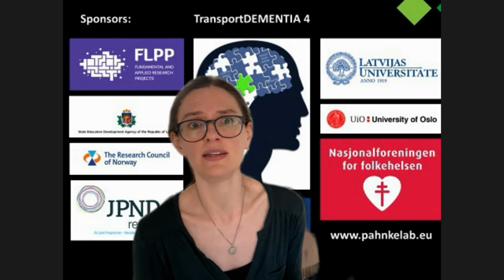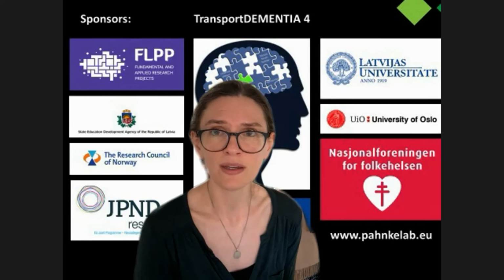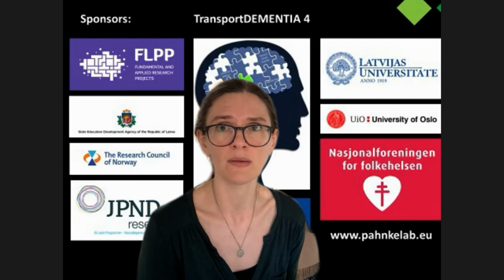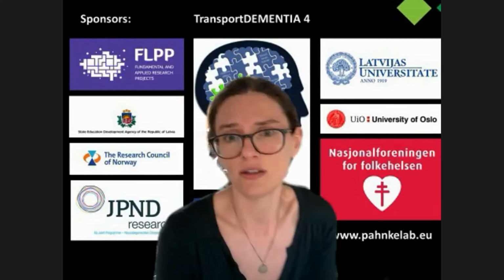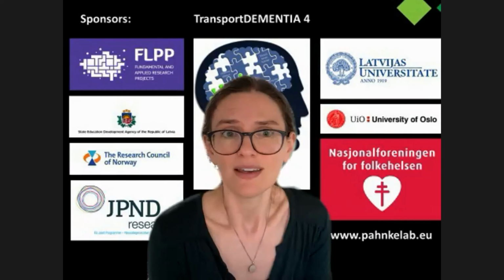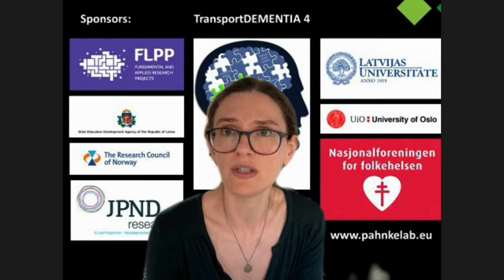You can use the validation also to see, is it rather having a problem with too many detections, so too many false positives, or does it have a problem that it actually misses many microglia? So you can focus your training on that a little bit. Yeah. So yeah, you have to do it for every image or every type of image. You have to redo the training.